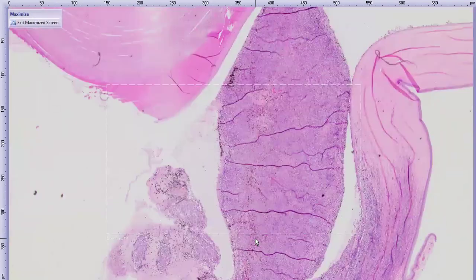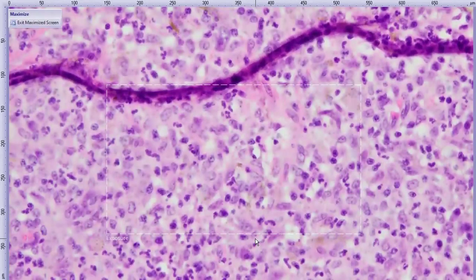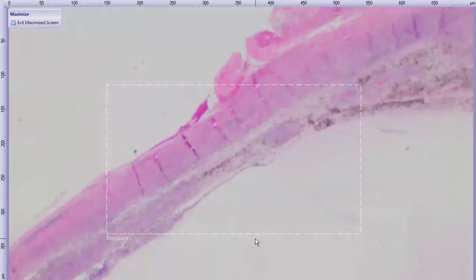And if we take a look at the character of this inflammation, it's a lot of macrophages, many of which are laden with melanin, lots of lymphocytes and plasma cells, and in this case, a good number of neutrophils as well. The uvea was overtly necrotic in a lot of areas, and probably those neutrophils are responding to that. And this patient was a bilateral enucleation case. And you might think that I'm showing you the same slide again, but I'm not. This is the other eye. And it looks basically just the same.